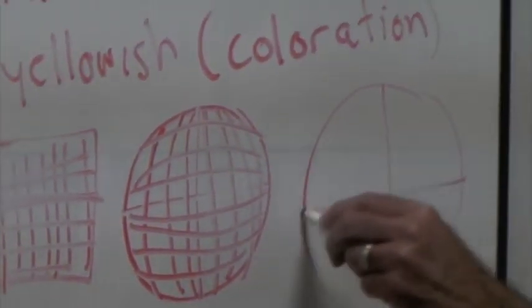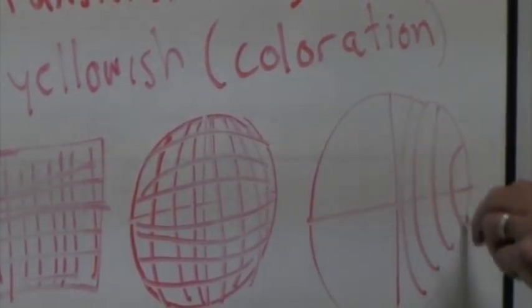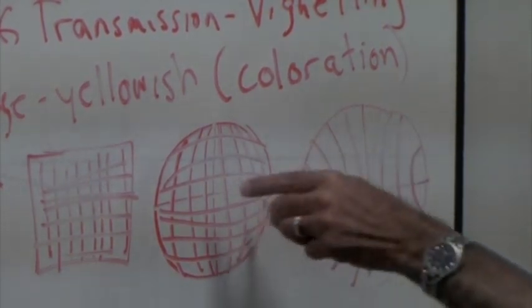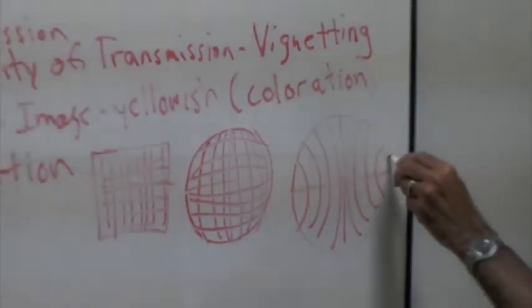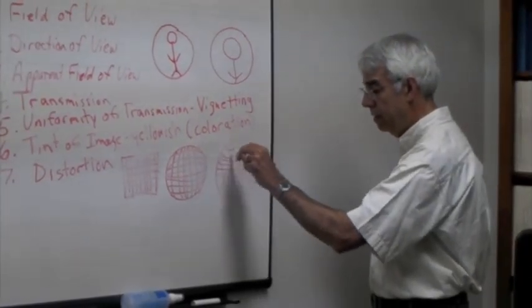the center. It is possible to get a distortion that looks like this, but never in an endoscope. It always looks like that. That'd be a concave lens or something, right? Yeah. Yep.